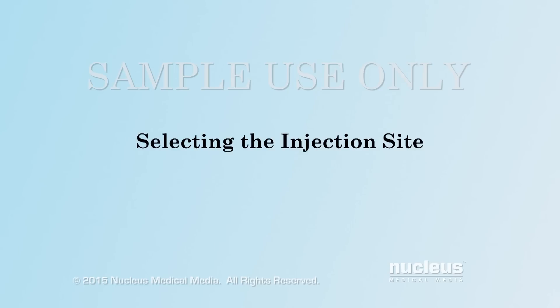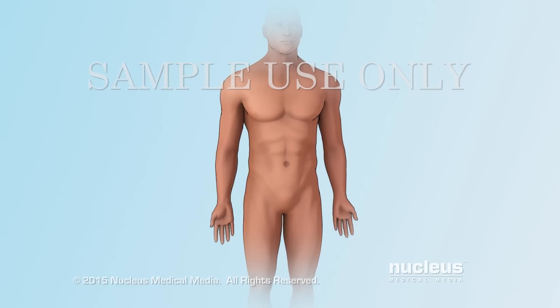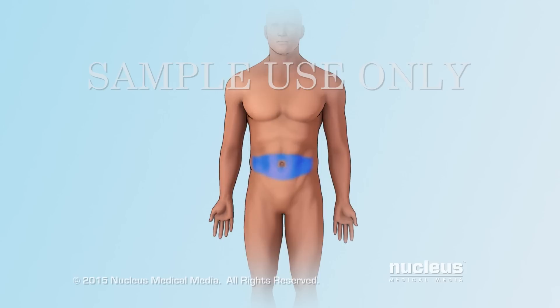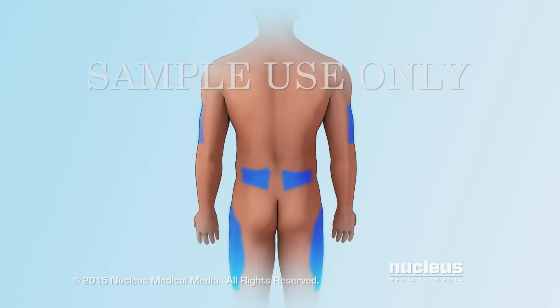Selecting the injection site. Before injecting your insulin, select the injection site on your body. The areas for insulin injection include the abdomen or belly, upper arms, the thighs, and the buttocks.